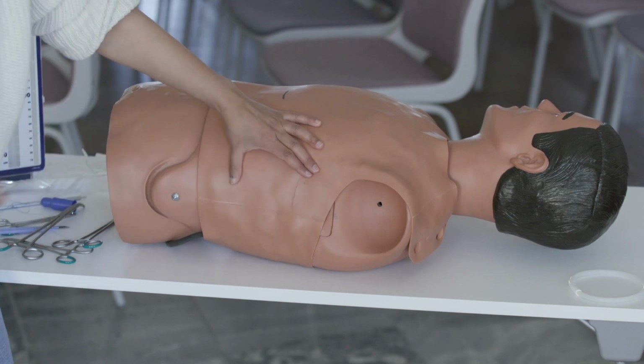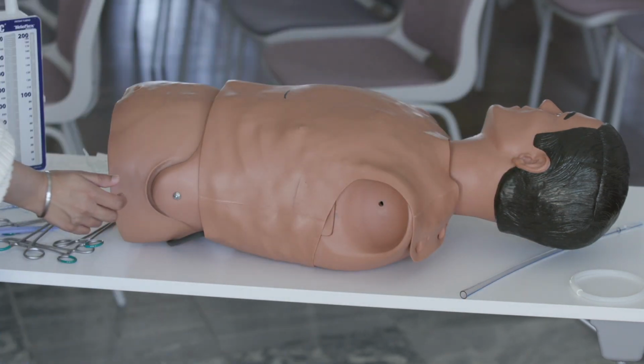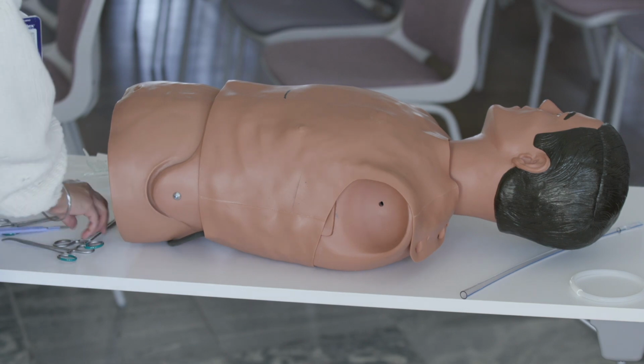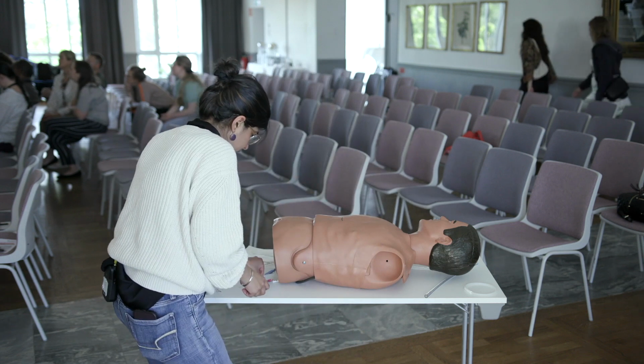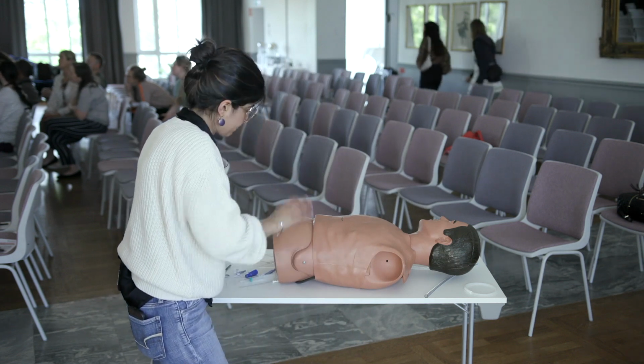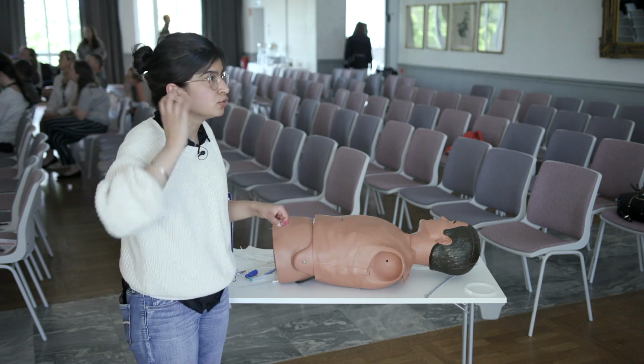So everyone's familiar with our basic Seldinger technique for things? Yes. So basic Seldinger technique, right? Now this may be, again, a traumatic hemothorax, a pneumothorax, or you may just be doing a pleural drain for a pleural effusion that's accumulated over time, right?